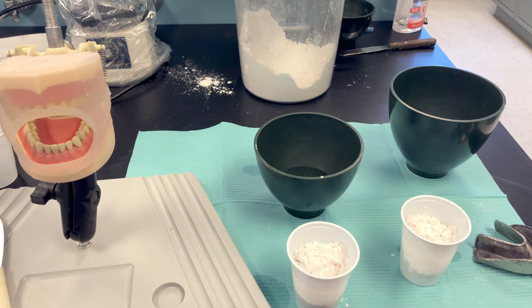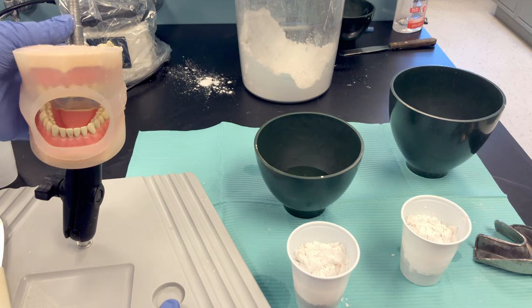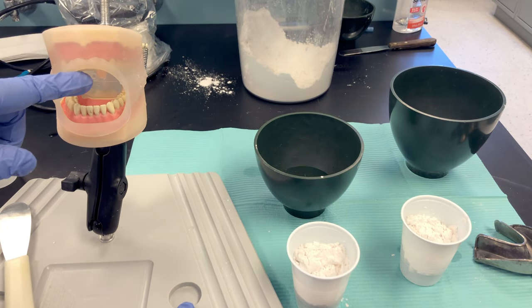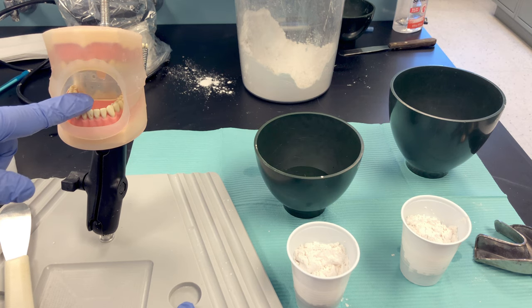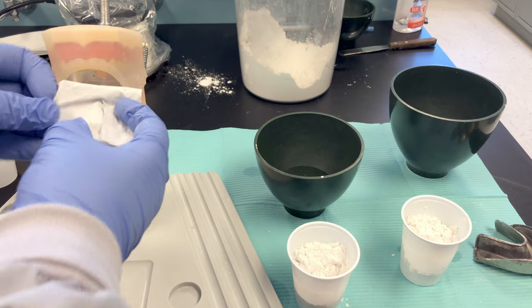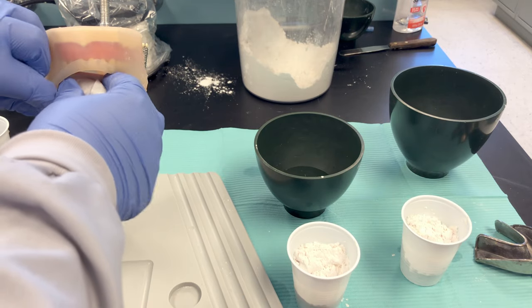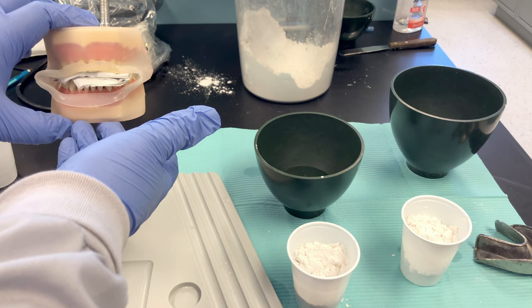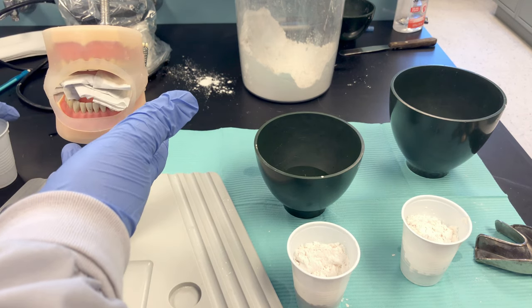With room temperature water, you have about 30 seconds to mix and 30 seconds to load it into the tray and position it in the patient's mouth — a few things must happen very quickly. You need to dry the patient's teeth: either use an air-water syringe just before inserting the tray, or have them bite on gauze.